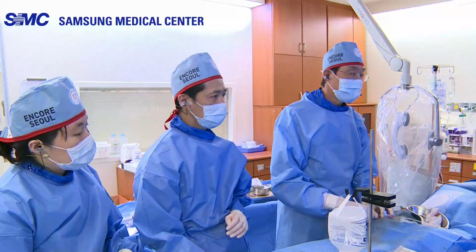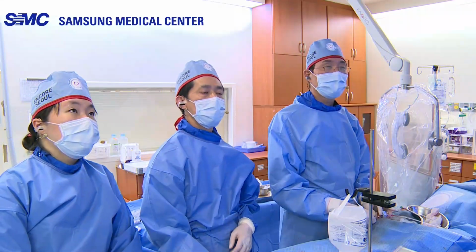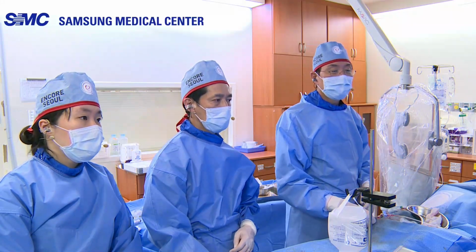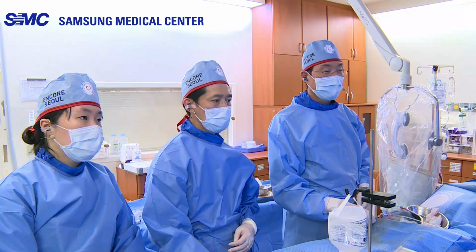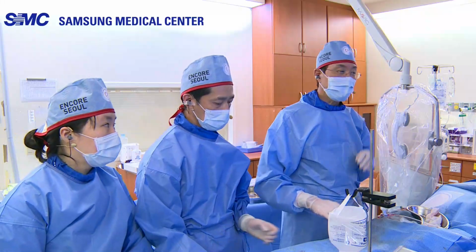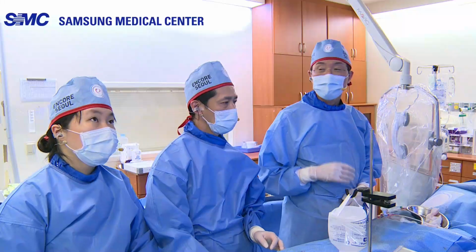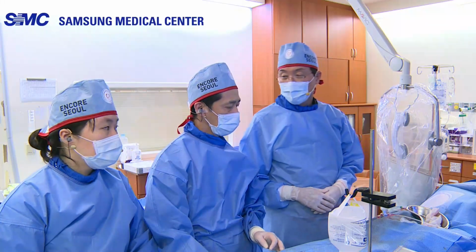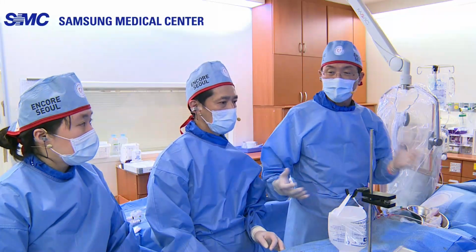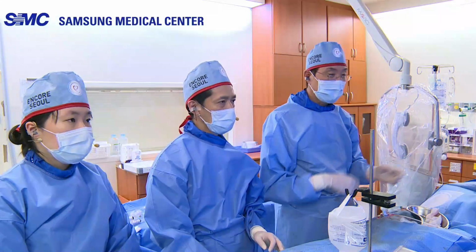I think the restenosis process starts in the very early phase after PCI, by adhering platelets and fibrin material. That would be a nidus for neointimal growth. Theoretically, I agree with you. But clinically, I expect the TLR rate around 10 to 20%, so there is an 80 to 90% possibility of no TLR, at least for 1 year. So this is a fair trade between the stent and bleeding risk and the TLR rate.